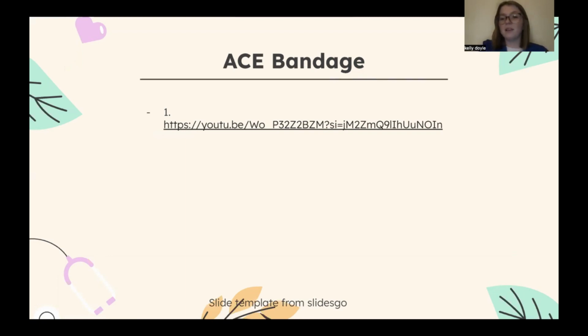Okay, so something I really liked about the ACE bandage video is how Skylar talked about the method of wrapping from the bottom to the top, showing us that we're pushing the blood flow back into central circulation. If you keep that goal in mind, applying a compression device is going to be so much easier because you're going to understand how this is working and what you need to do to ensure that it's working. Keep in mind that the clip and the Velcro could be a risk for tearing in older adults' skin.